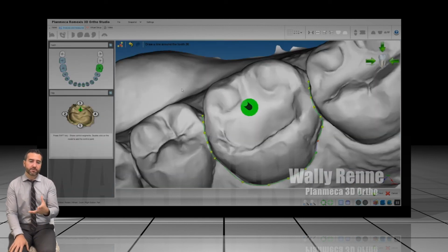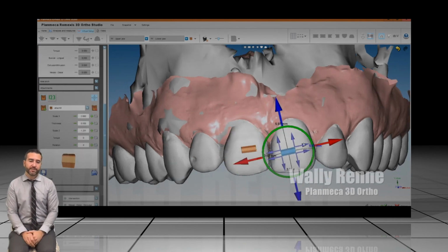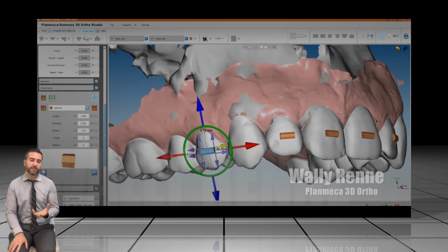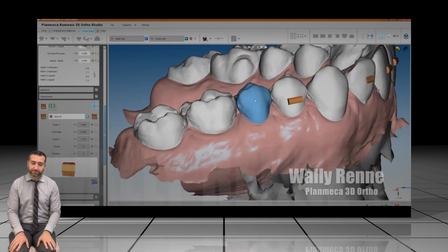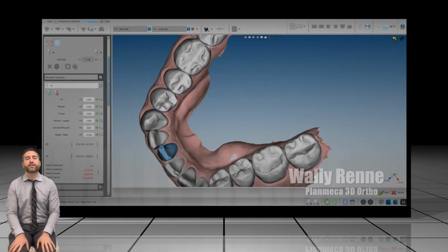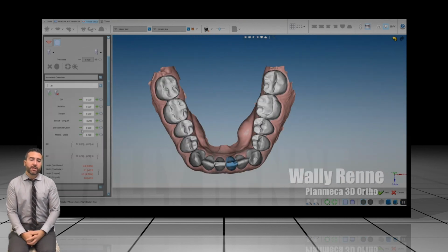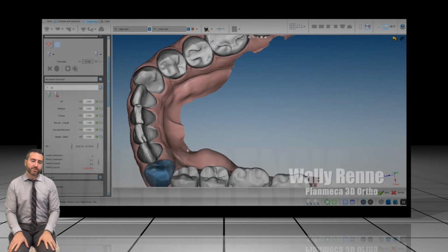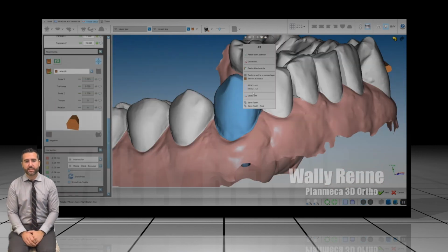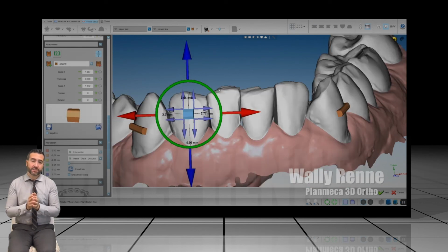Auto segmentation, we're able to add as many attachments as you want. In this particular case, I've also combined with CBCT so that when I'm moving the teeth, I'm able to see where the roots are in bone, and to make sure that I'm not going to cause any premature dehiscences or fenestrations, and make sure that I'm being realistic to what this patient presents with. And you're able to do interproximal separation as well, and you're able to instantly check occlusion in most of these softwares. And this just keeps getting better and better and better with artificial intelligence.